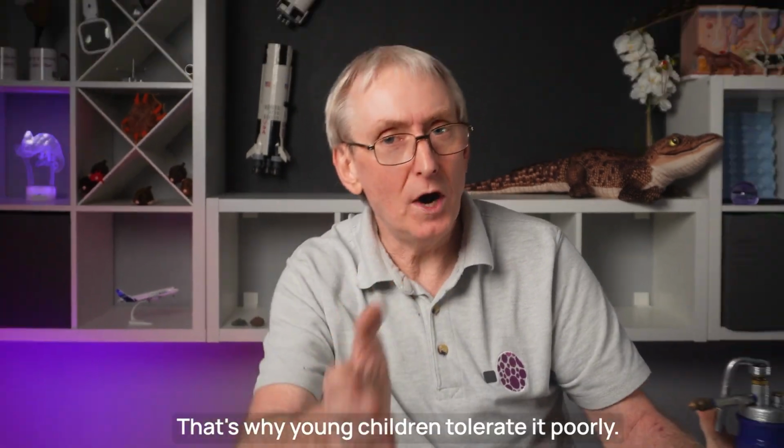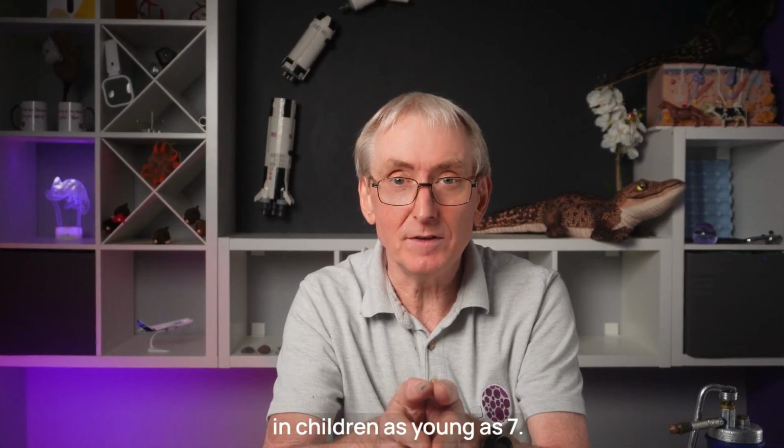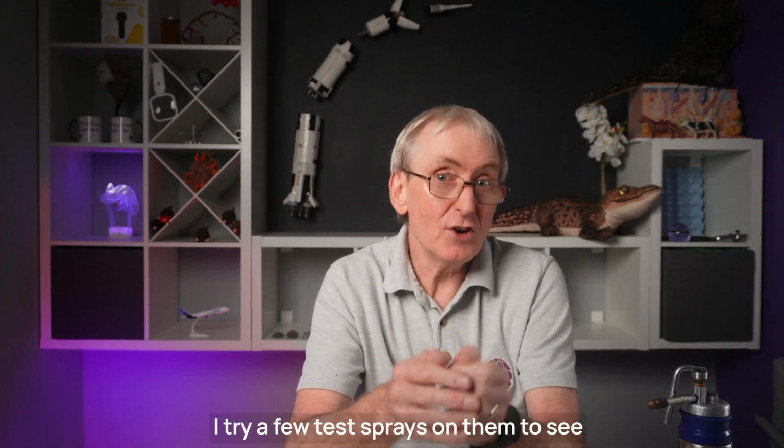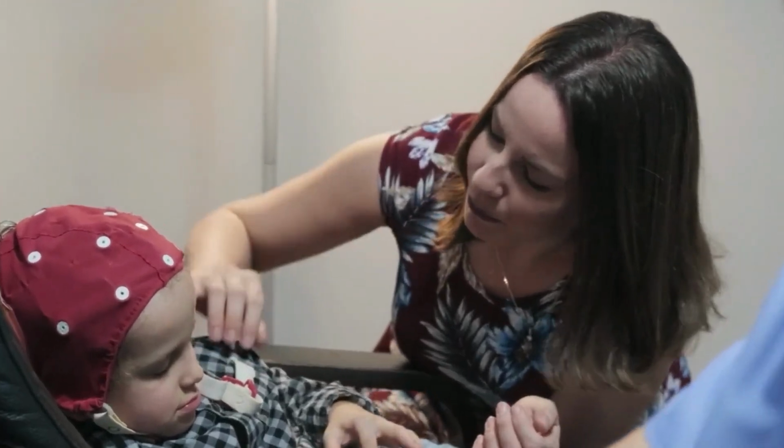Ow! That's why young children tolerate it poorly. But I have frozen warts in children as young as 7. I take each child on their merits. I try a few test sprays on them to see if they can tolerate it for long enough. Be aware of parents persuading them.